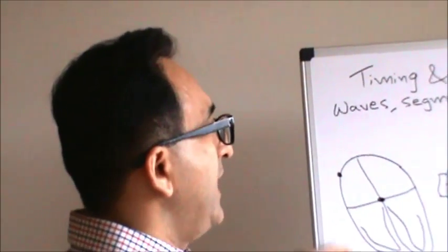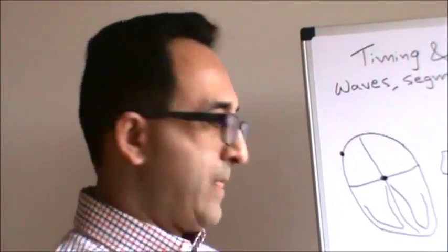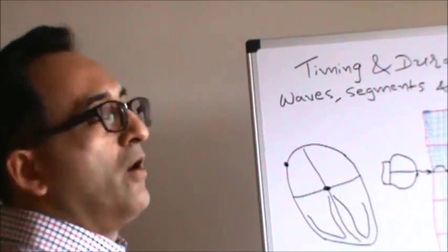Okay, so that entire process takes what? How many seconds? 0.20 seconds. Now we know our alphabet. Guess, on average in a normal heart, what would be the duration of the next QRS complex, or the QRS interval, right? I'm trying to unfold this so that those studying it for the first time can easily digest and understand. You don't need to be a rocket scientist to understand this.